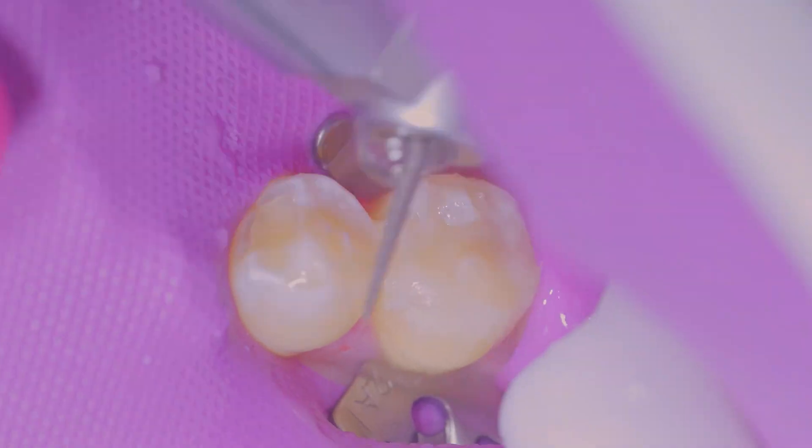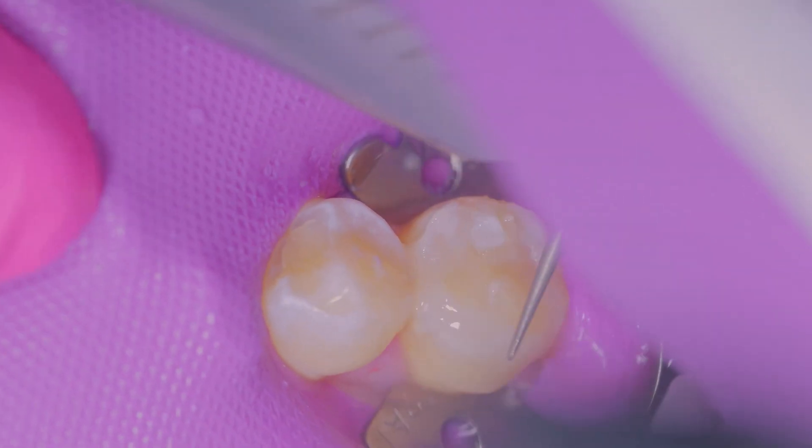Once the material is set, it's very easy to polish and the final result is a beautiful restoration that you were able to achieve in a short amount of time.